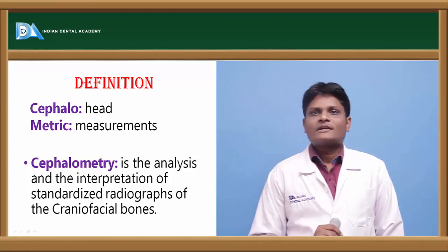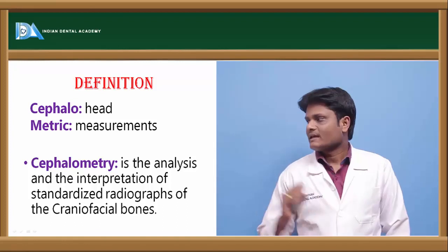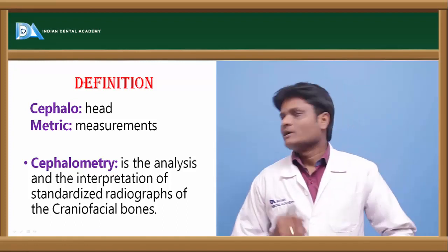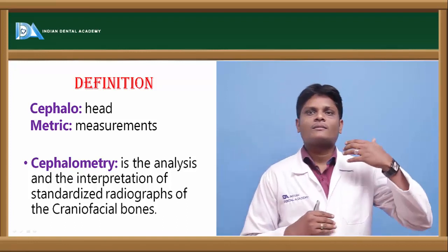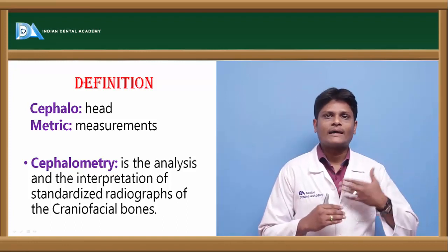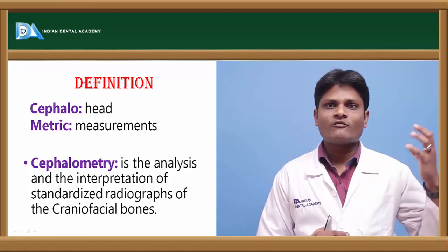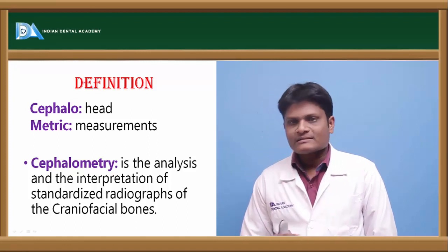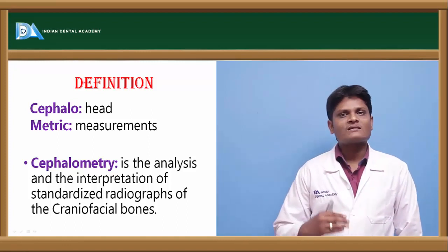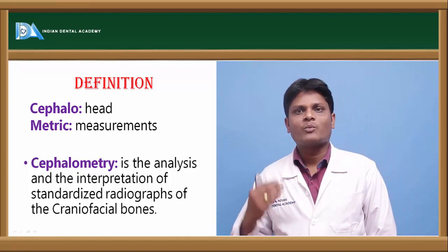When we see the definition of cephalometry, it's nothing but analysis and interpretation of different features or different measurements of the head that are made on the standardized radiographs obtained of craniofacial bones. So cephalometry is analysis and interpretation of different standardized radiographs taken on craniofacial bones.